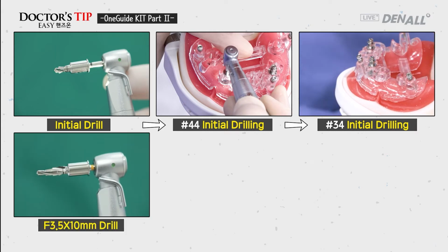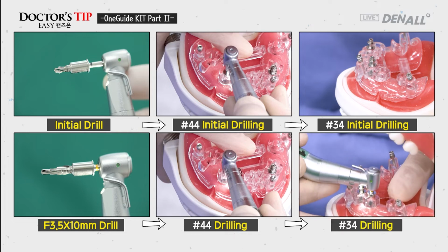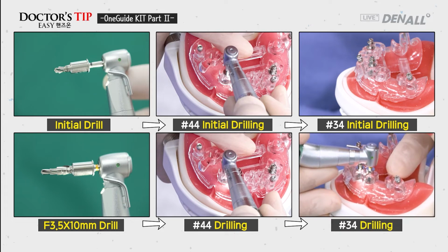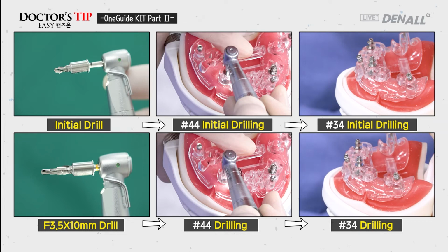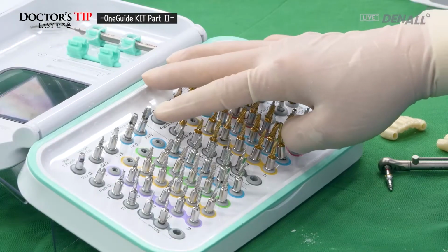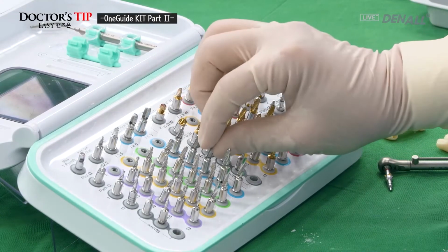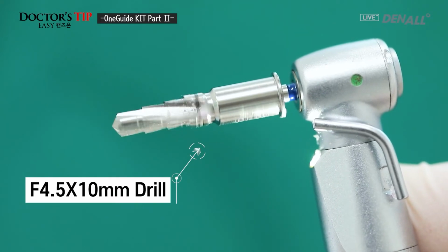4.5 by 10 millimeter. So 3.5 by 10 millimeter one guided drill is used. And on number 44, double contact concept is used to do drilling. And on number 34, drilling is done full length. Up and down and done. 4.5 by 10 millimeter implant is going to be placed. So final drill is 4.5 by 10 millimeter one guided drill. And on both sides, final drilling is done.